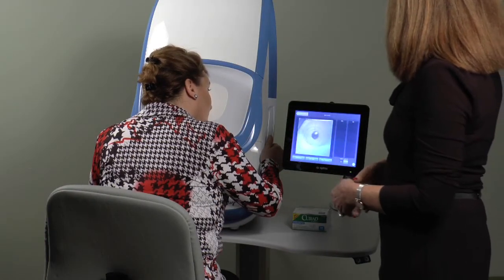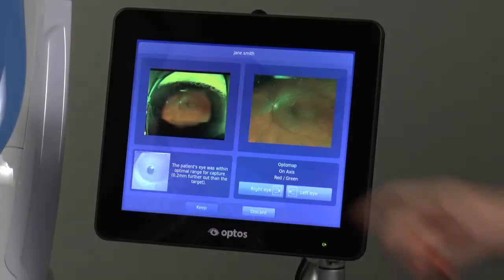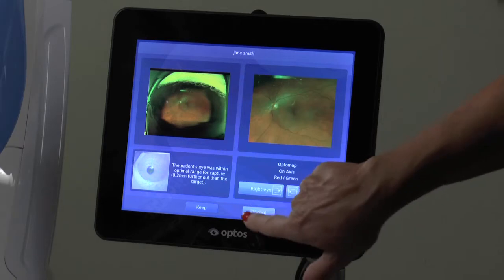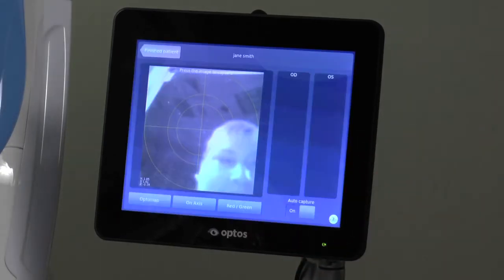Then an image will be taken if auto-capture is active. If the image is not satisfactory, you may choose Discard, then Delete, which will permanently delete the image. You may prefer to keep all images and wait until the end of the session to delete.